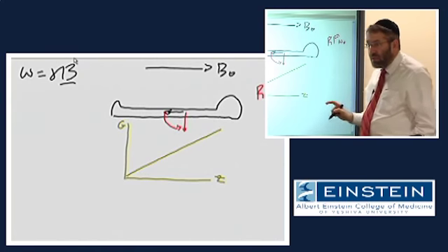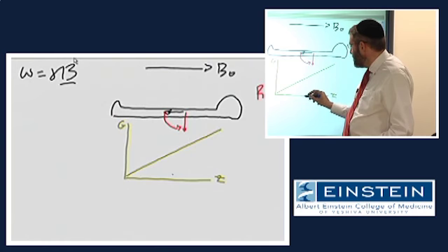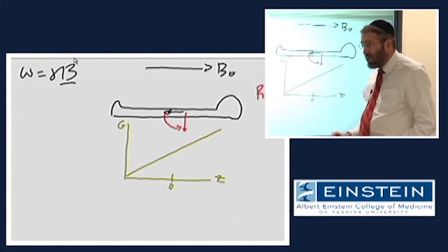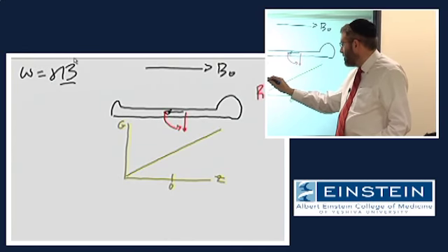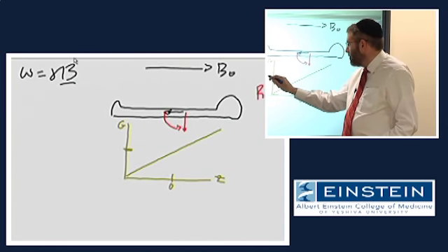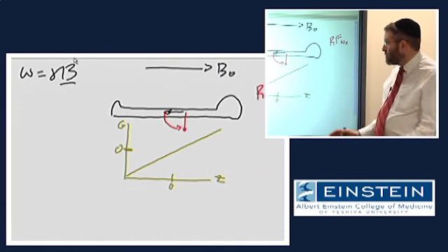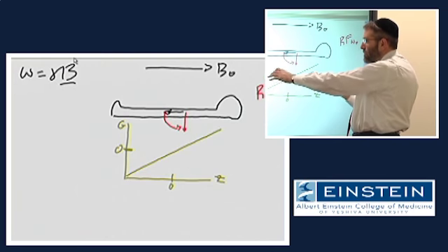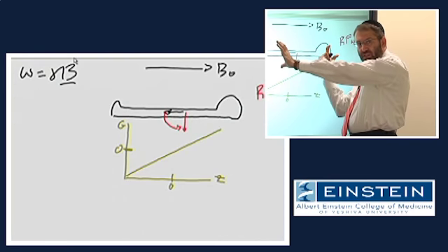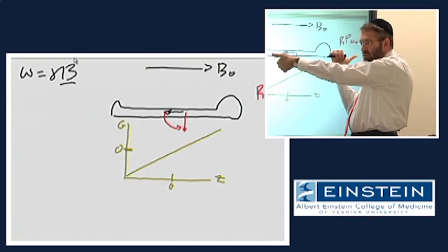Now, as we discussed yesterday in talking about some of these hardware issues, there's some location in the scanner called the isocenter of the scanner. At that location, gradient amplitude will always be 0. Remember, this Z gradient magnetic field, which we discussed yesterday, is generated by two electromagnets, one at each end, which have equal and opposite magnitudes.